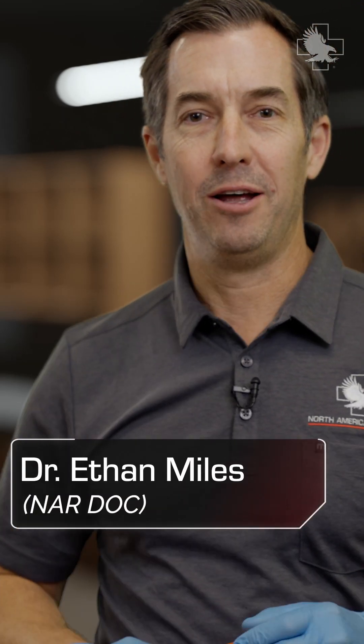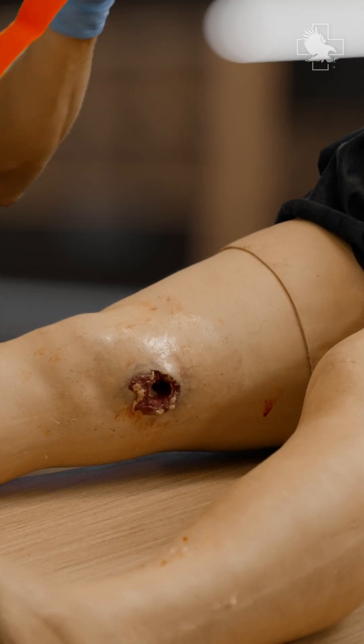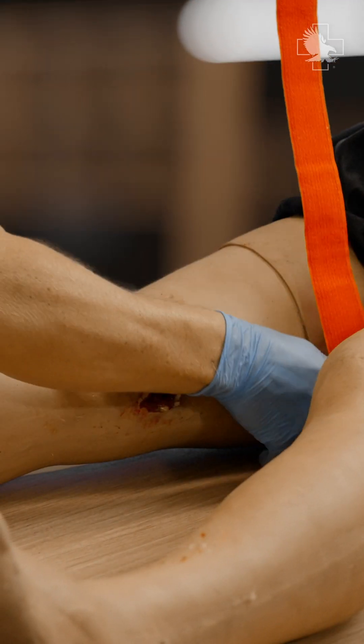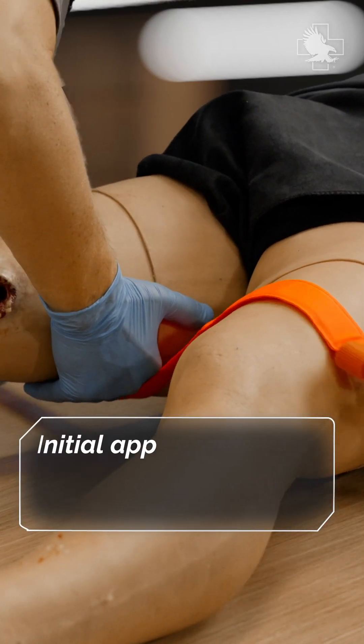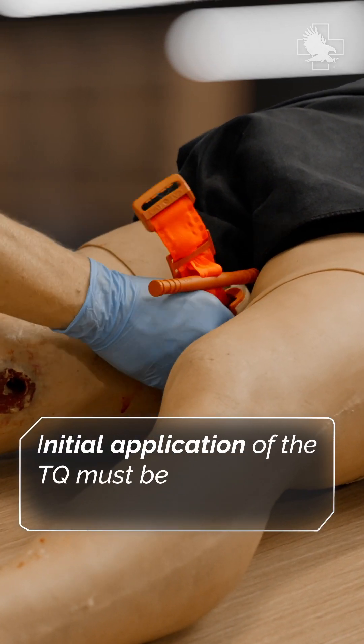Hey everyone, Doc Miles. I'm going to be talking about tightening a tourniquet and if a tourniquet can be put on too tight. What I want to do is place the strap from the middle out to the outside, and what that's going to do is help me as I tighten the tourniquet on my casualty.